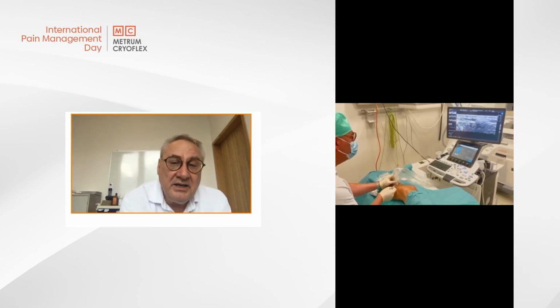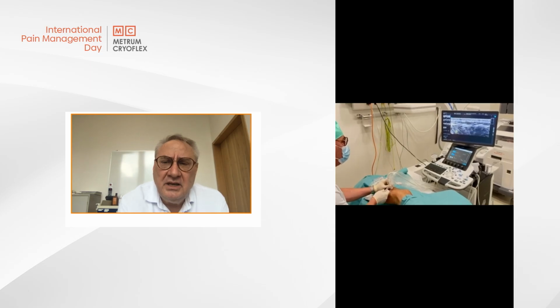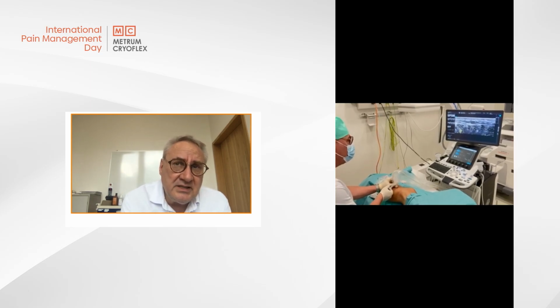He has a follow-up in 5 days, and we're going to see if he has any clinical signs for the next treatment, or maybe we don't have to do anything. So again, we are doing a procedure which tells us the way and which gives us the possibility of both options.